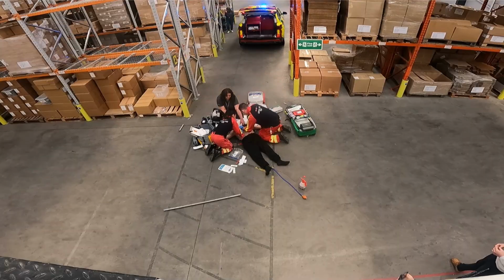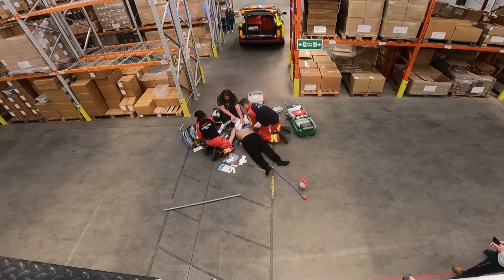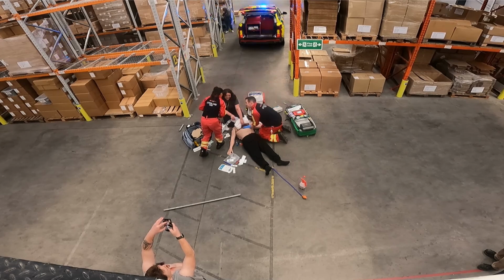And what they'll then do is internal chest compressions. So just like you do for CPR externally, what they're doing is internal chest compressions, squeezing the heart from the apex of the heart upwards, pushing that blood around the body, hopefully getting a return of spontaneous circulation. So we'll be looking at the monitor, seeing if there's any changes, seeing if the end tidal, the amount of CO2 that's being blown off the patient, rises or changes, which is normally the first sign of a potential return of spontaneous circulation. And Ollie will just be doing chest compressions just as you would with external chest compressions, but we're obviously inside the patient's chest at this point.